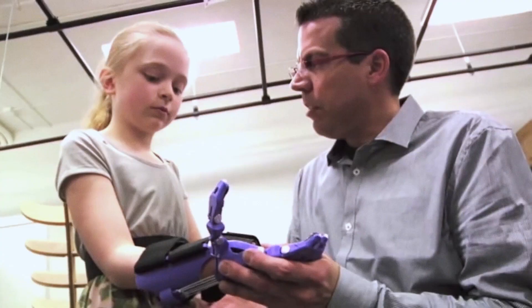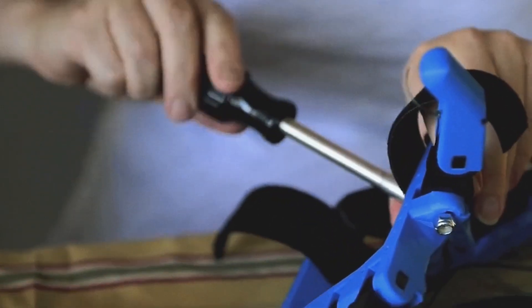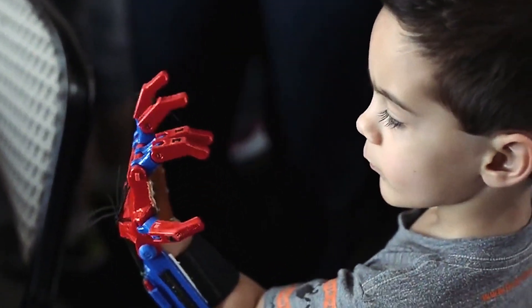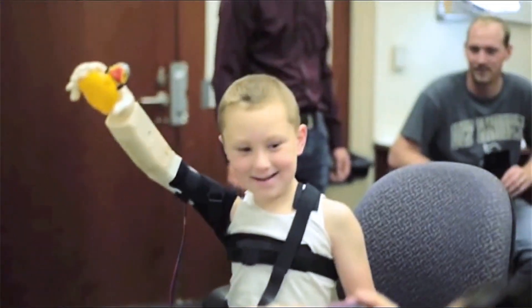Enable is an online, global community of volunteers who are using 3D printers and 3D design software to make prosthetics for children and adults who are missing fingers, hands, and wrists. And we're giving them away for free.